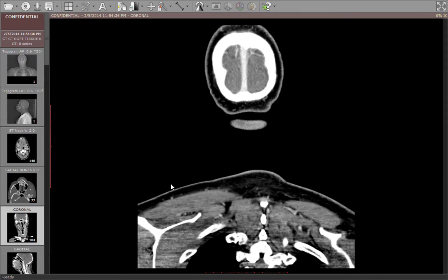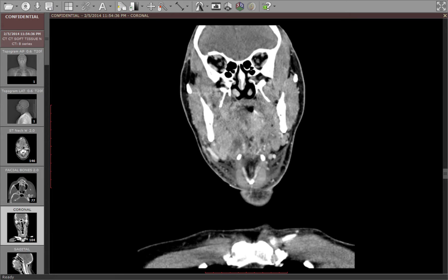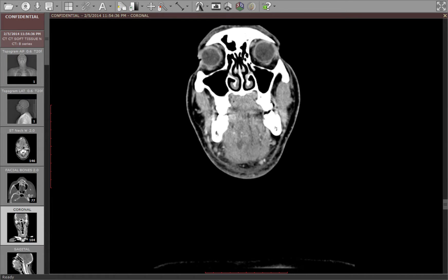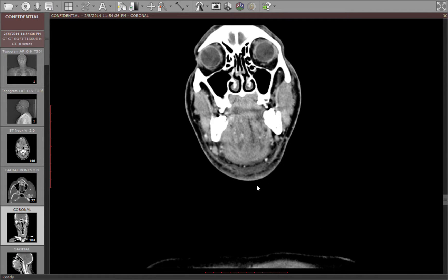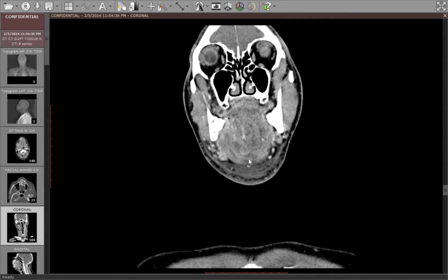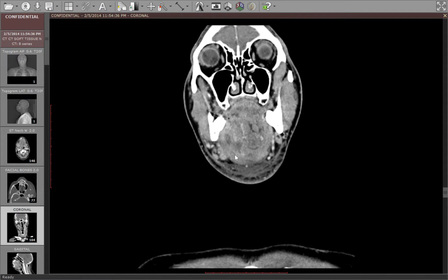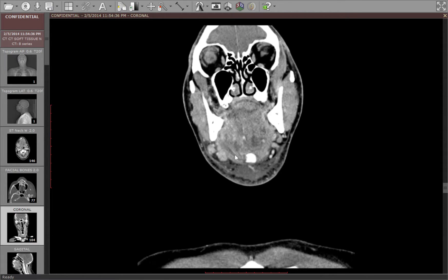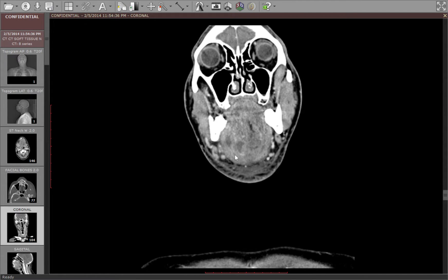Let me show you on coronal. Everything above the mylohyoid muscle is the floor of the mouth. The mylohyoid muscle is like a sling that inserts on the lingual aspects of the mandibular bodies bilaterally. This is the mylohyoid muscle, and you can see that these fluid collections are on the right predominantly, in the sublingual space as opposed to the submandibular space, which is superficial or inferior to the mylohyoid muscle.